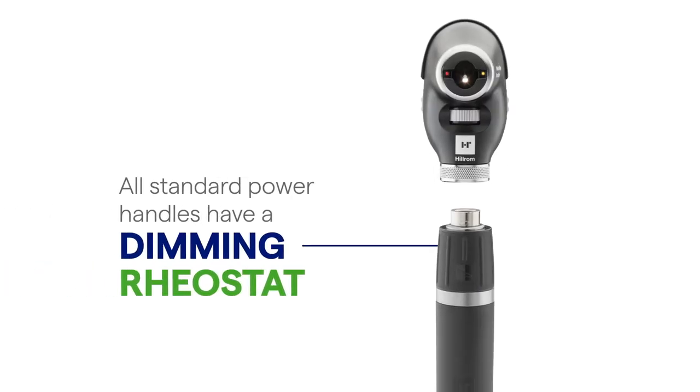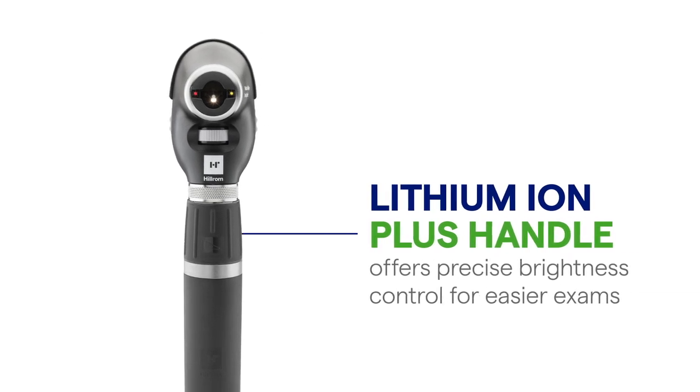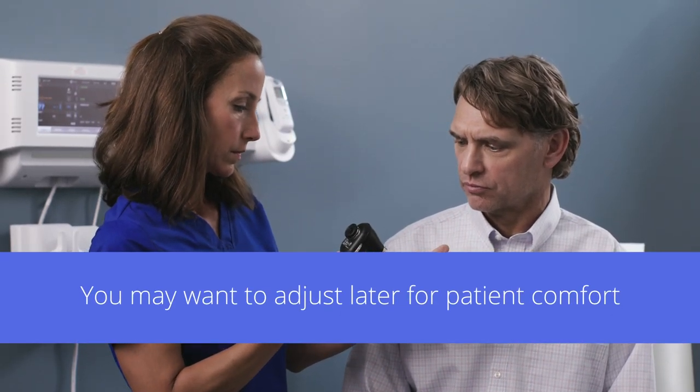All standard Welsh Allen power handles have a dimming rheostat, and the Lithium Ion Plus handle offers precise brightness control for easier exams. Turn the scope on to full intensity. You may want to adjust later for patient comfort.